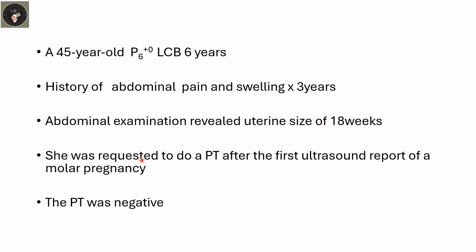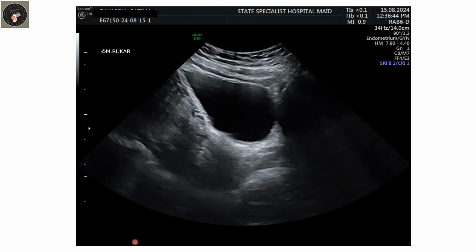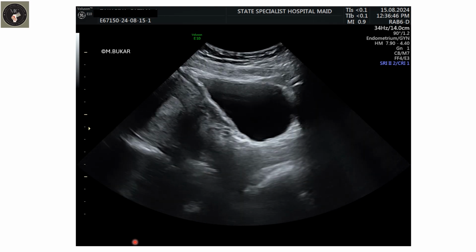She was asked to do a pregnancy test after the first ultrasound diagnosis of molar pregnancy. The pregnancy test was, however, negative. So this is a transabdominal video. Let's see what made the sonologist arrive at a diagnosis of a molar gestation.